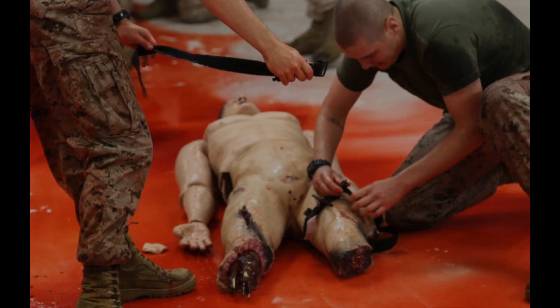People always ask what's the difference between a ratcheting tourniquet and a windlass tourniquet. Both tourniquets work, but windlass tourniquets have two distinct design flaws. All windlass tourniquets are single use, meaning if you buy just one, you cannot train with the tourniquet you are carrying without the risk of failure when you really need it.